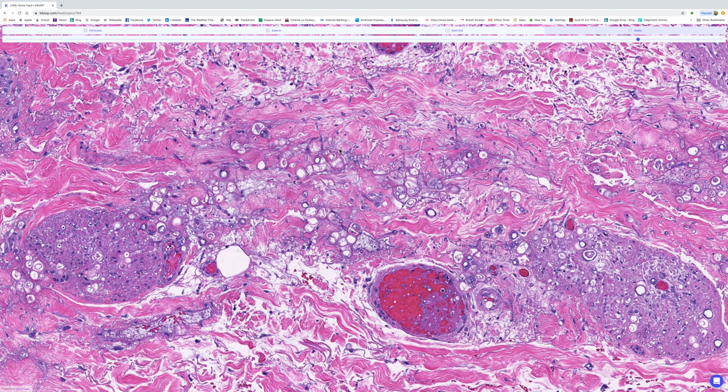I've seen quite a few cases of intravascular fungal infections in the past, but nothing is anywhere near as dramatic as this case. It's absolutely amazing. And you can see there are septate hyphae scattered around the place, and within the vessels and also in the dermis are very large, conspicuous, thick-walled spores or conidia.